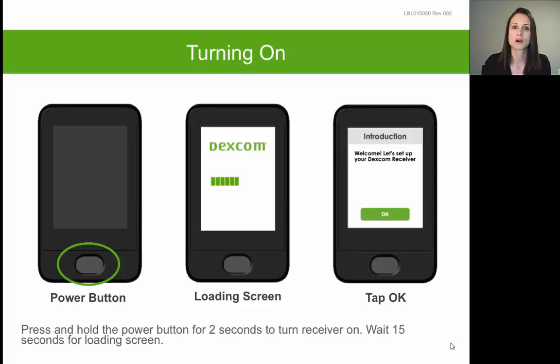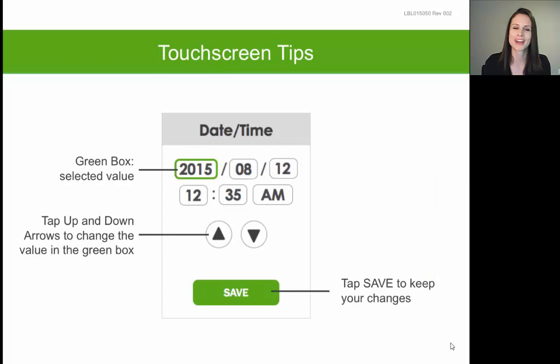The loading screen will disappear on its own within about 15 seconds and then display a welcome or introduction screen. When you see this, tap on the word OK, and this will result in a series of setup screens.